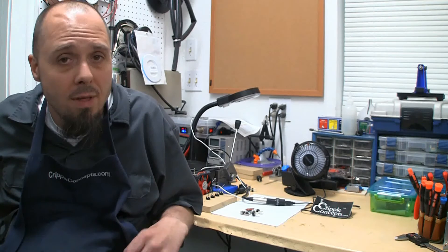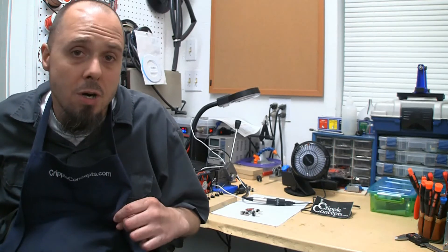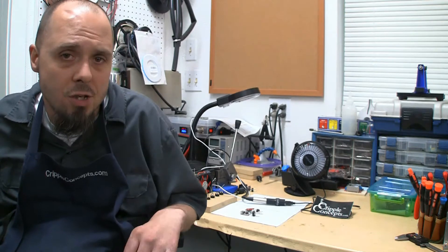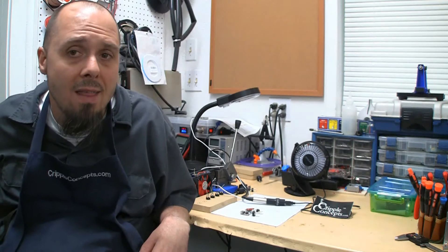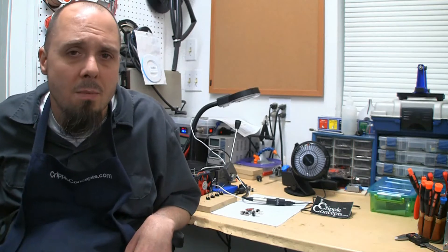I tried a few different things, and I ultimately ended up with an extra diode on the leads between the actual plug that goes into the chair and the circuit board itself. And that solved my problems, and solved problems for a few of my customers that had the same problem.